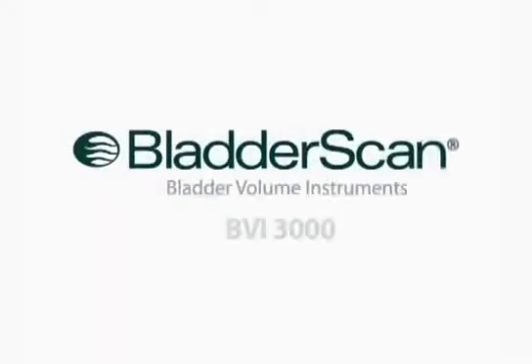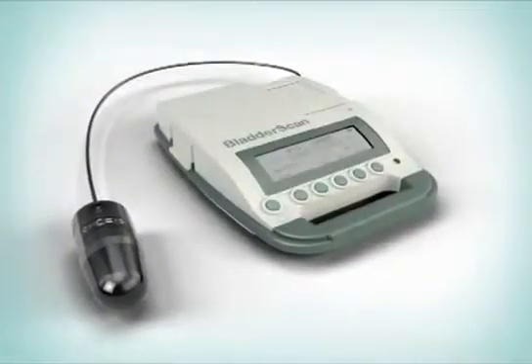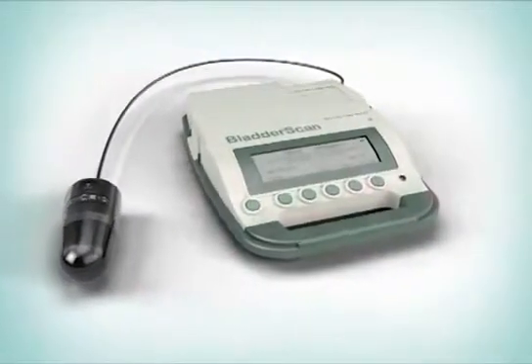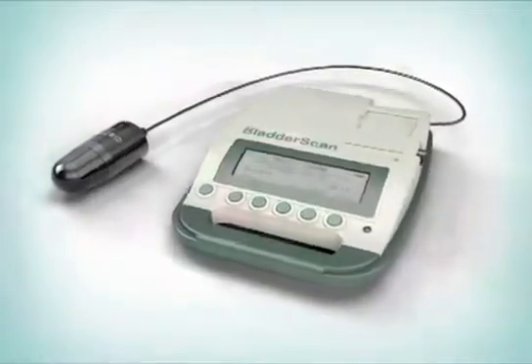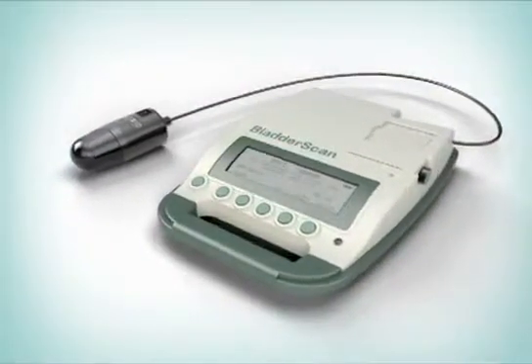Introducing the BladderScan BVI3000 Bladder Volume Instrument — a portable ultrasound device that quickly, accurately, and non-invasively measures bladder volume to help assess common urological problems.